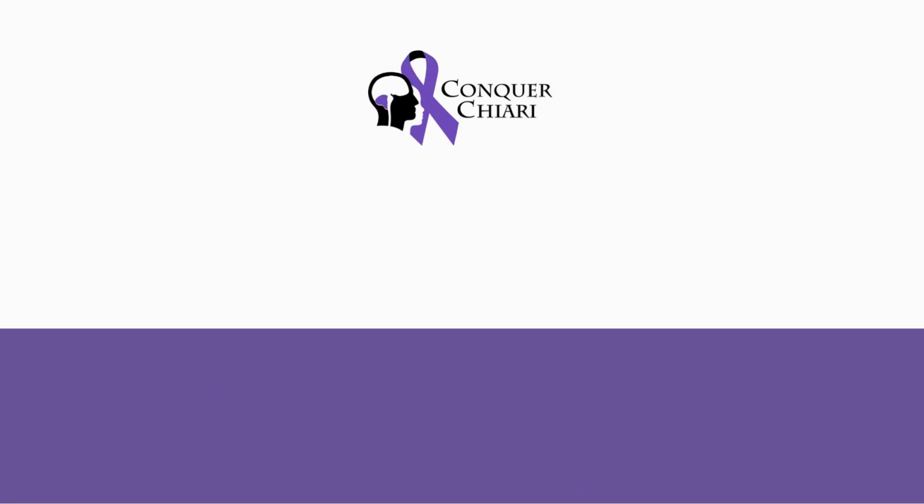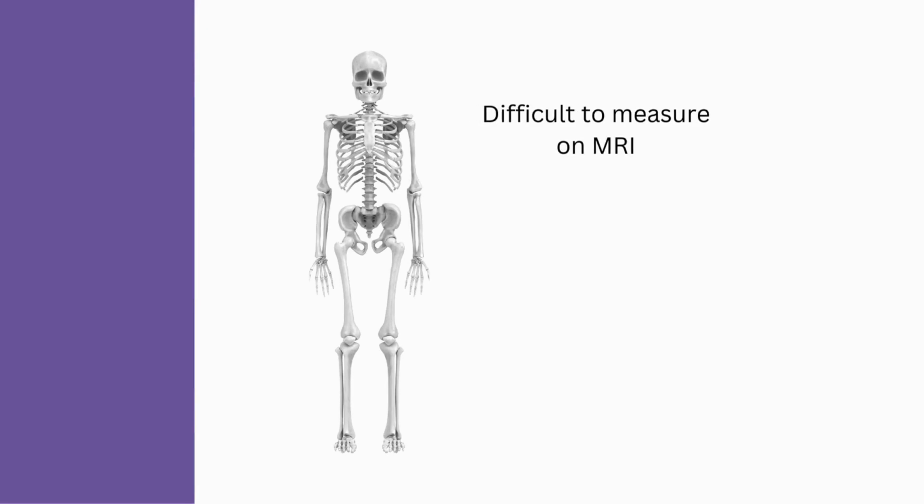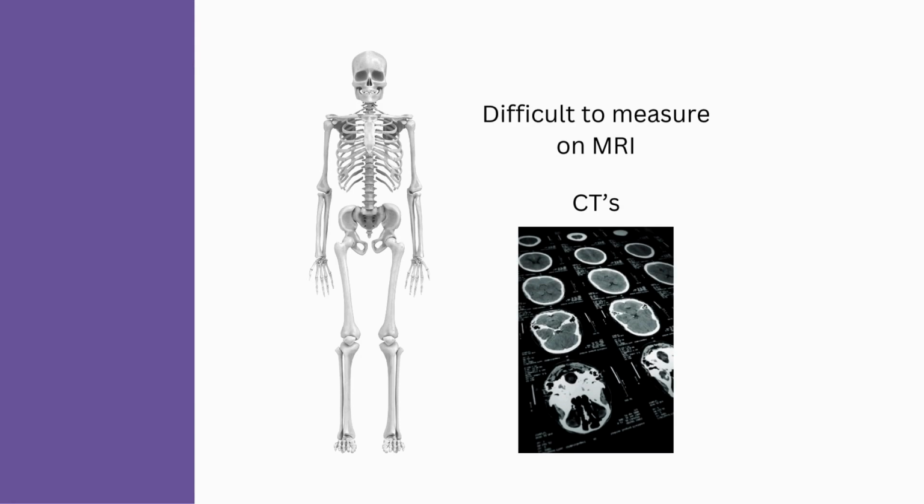While these MRI-based findings are significant, a Conquer Chiari study of the clivus bone using CTs revealed even more dramatic differences. Bones can be difficult to measure on MRI, but CTs, which are a fast series of X-rays controlled by a computer, allow for very precise measurements of bones.